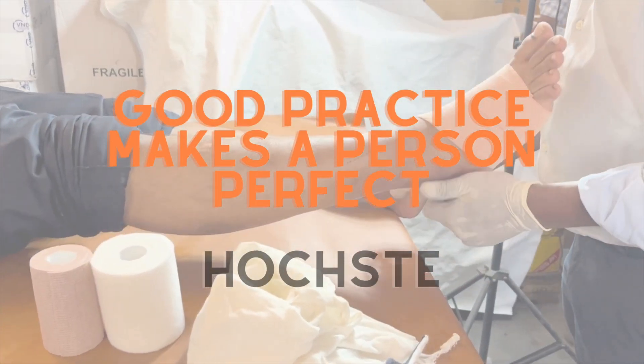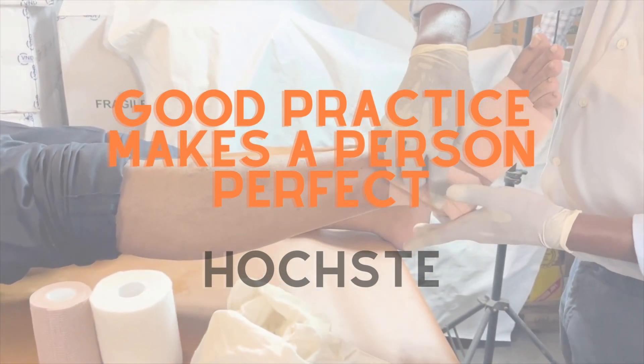Use a crepe bandage for practice. Good practice makes a person perfect.